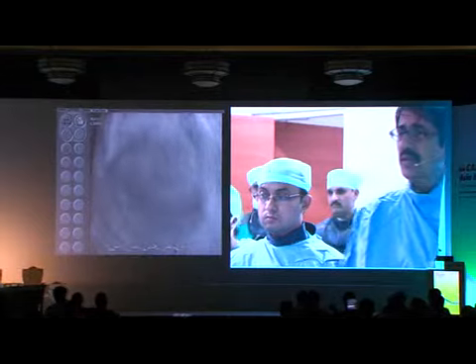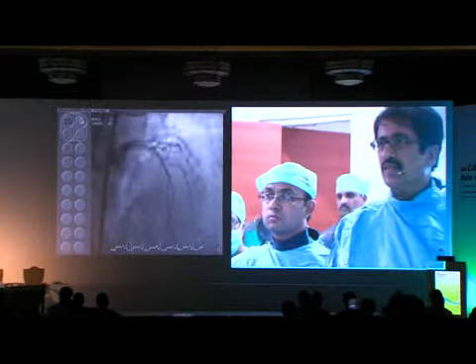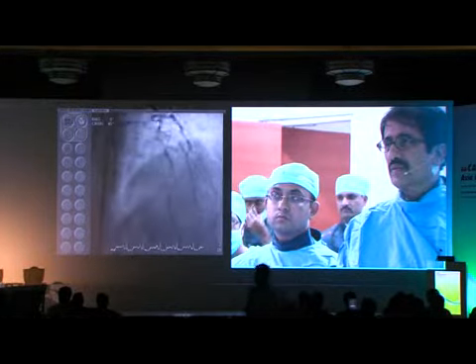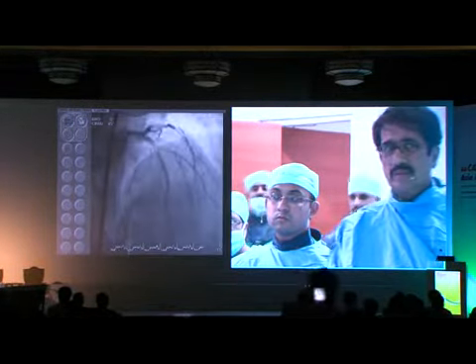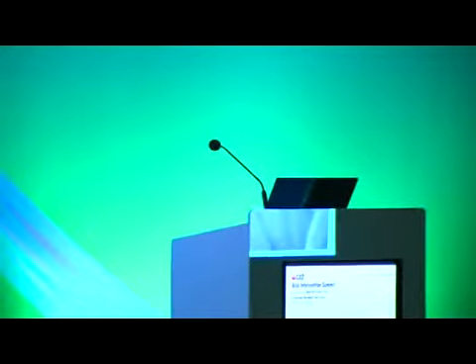So the diagonal certainly needs to be addressed. Any thoughts as to how somebody would do it? On the LAD lesion, Shirish, we have a bit of a diagonal view from the chairpersons because the screen in front of us is not functioning. From where we are sitting, the diagonal is significant, about 90% plus, and about a 60% lesion of the LAD. And the LAD doesn't appear to be too significant from where we are looking at it. I will ask the opinion of my other colleagues.